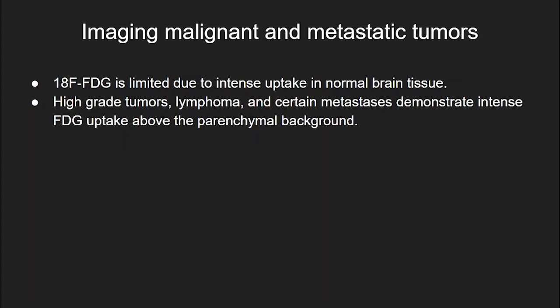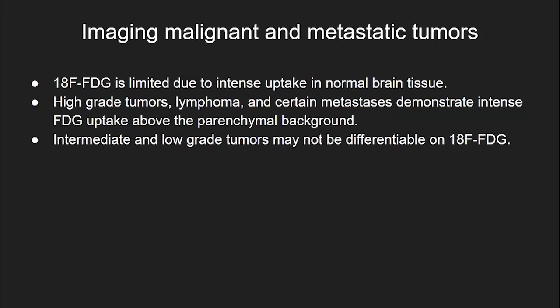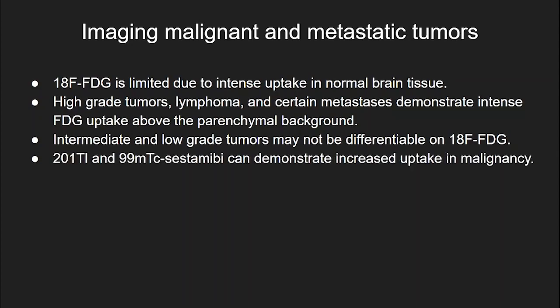High-grade tumors such as lymphoma and certain metastases demonstrate intense FDG uptake that is above and beyond the parenchymal background. Intermediate and low-grade tumors may not be differentiable on 18F-FDG due to this background activity. 201 thallium and 99m technetium sestamibi can demonstrate increased uptake in malignancy.